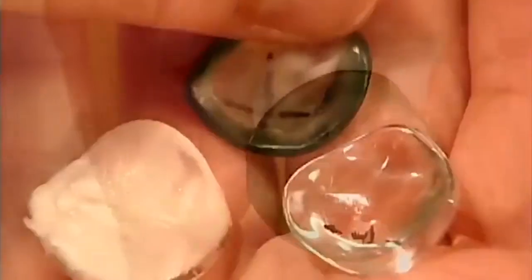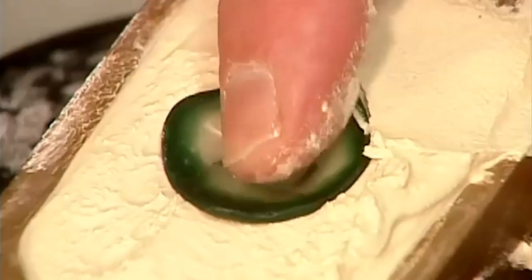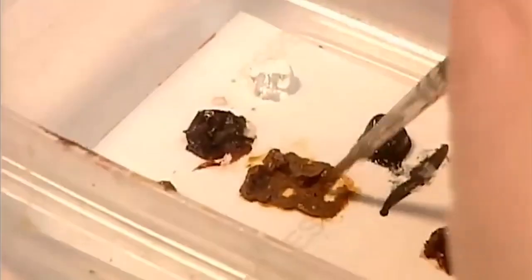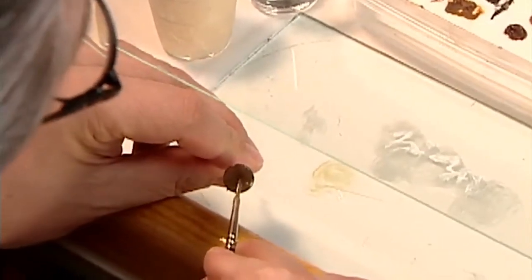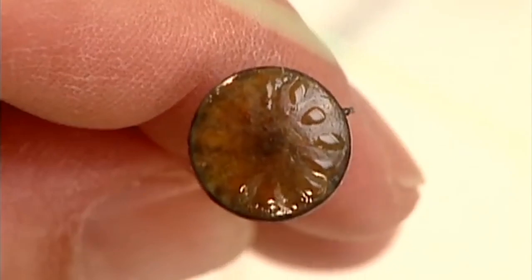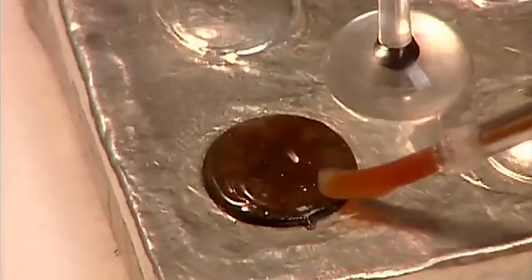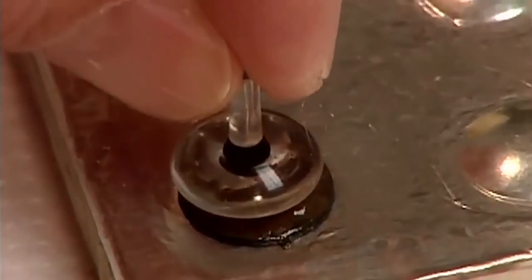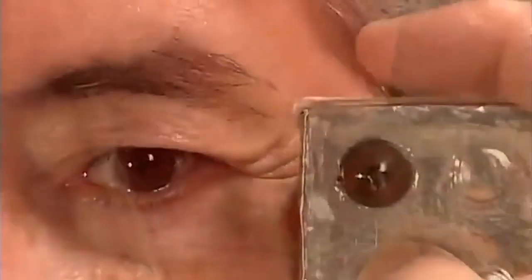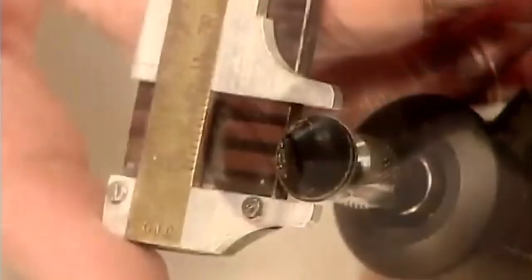Now they take this marked and enlarged fitting shape and make a plaster mold. They'll later use that mold to cast the actual artificial eye. But first, they have to make the iris. They take a curved black acrylic disc and paint it as realistically as possible with high-quality artist's oils. The patient has to be present so they can match the real eye. Next, they glue an acrylic cornea with an appropriate size pupil onto the painted iris. At this point, the artificial iris is 13 millimeters in diameter. If the patient's real iris is smaller, they trim down the replica to match.